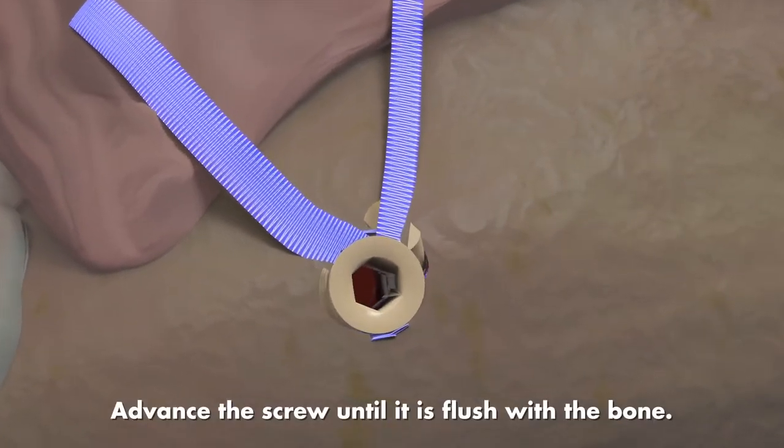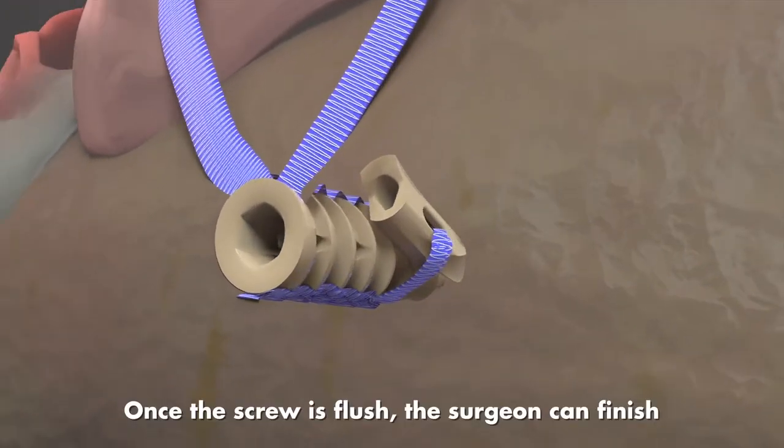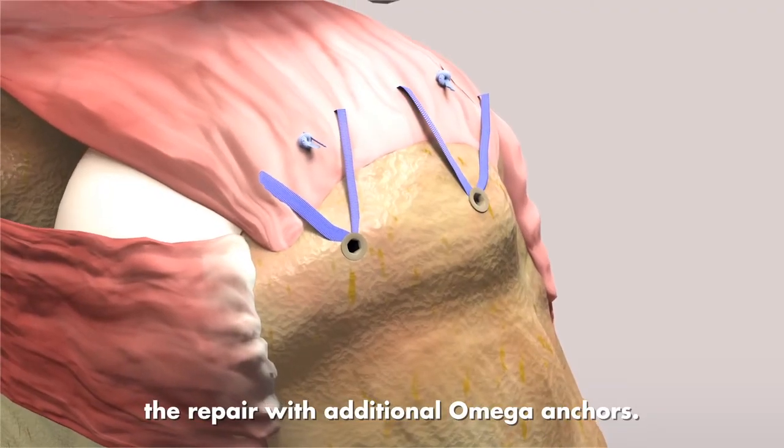Advance the screw until it is flush with the bone. Once the screw is flush, the surgeon can finish the repair with additional Omega anchors.